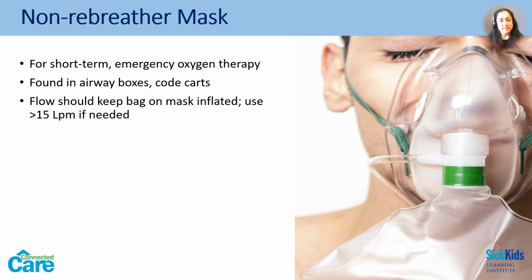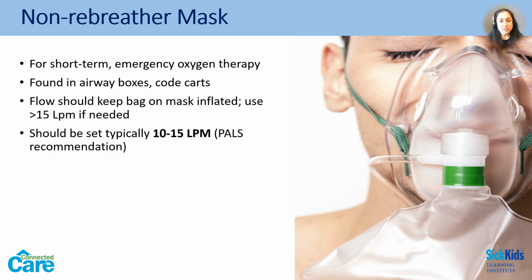Oxygen flow rates should be set so that the reservoir bag attached to the mask remains inflated during inspiration especially. The flow rates are usually between 10 to 15 liters per minute for children to adults, and this avoids rebreathing.